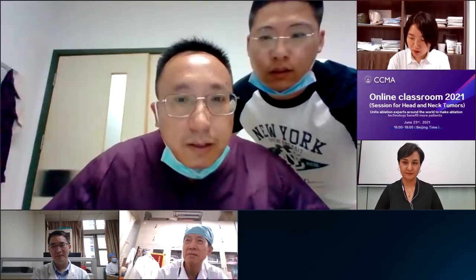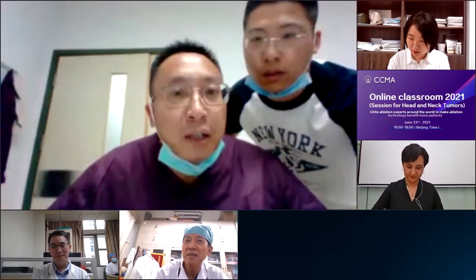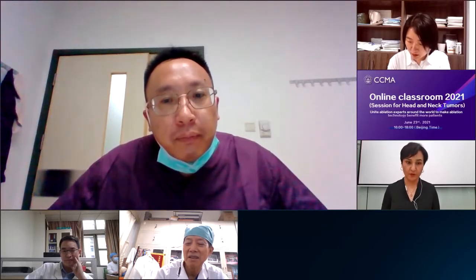Okay. The most important thing, Professor, is safe aspiration of the liquid in the nodule. Because when we aspirate the liquid, the nodule easily bleeds. Okay, bleeds. Thank you.